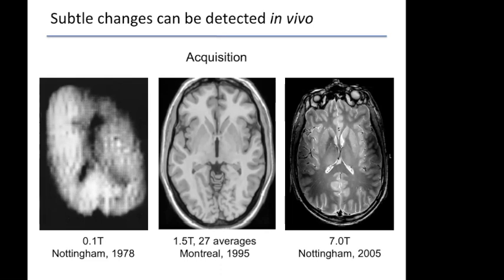And so what you end up seeing are, in the temporal lobes, for example, in the medial temporal lobes in particular, which is kind of where MRI almost made its bread and butter, there's tons of susceptibility and signal dropout in those regions. Same thing in the frontal poles and the frontal orbital cortex. Certainly, those are regions that suffer from that. So you have those things to contend with.